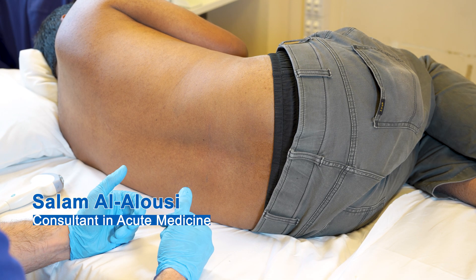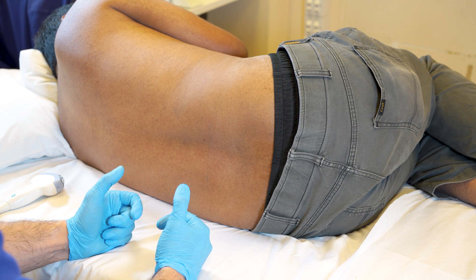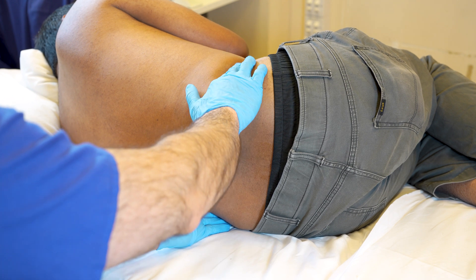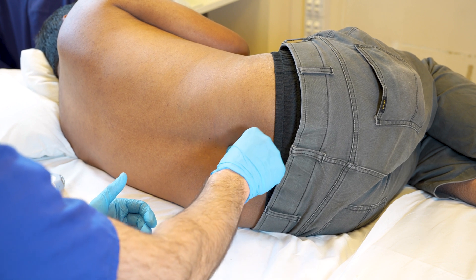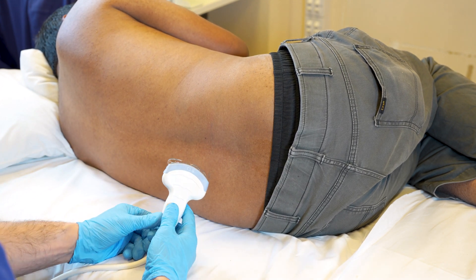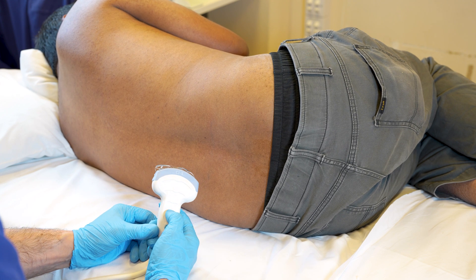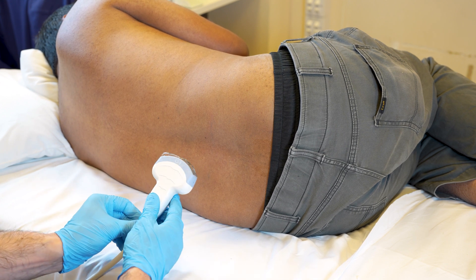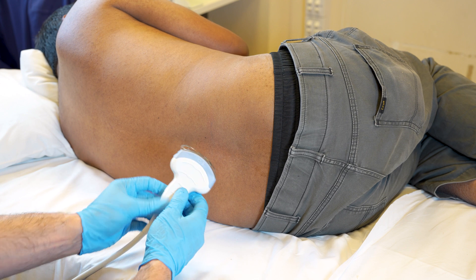My name is Dr. Al-Alusi and I am one of the acute medicine consultants at the Leicester Royal Infirmary. I will be demonstrating the ultrasound-assisted lumbar puncture marking technique on a live patient. Firstly, ensure your patient is in the correct position and use the conventional landmarks as a rough guide for where you'll be scanning and performing the lumbar puncture. Then take your ultrasound probe — in this case I'm using a curvilinear probe, which is able to look deeper than the linear probe. The linear probe on most ultrasound machines is limited to between six and nine centimeters depth.